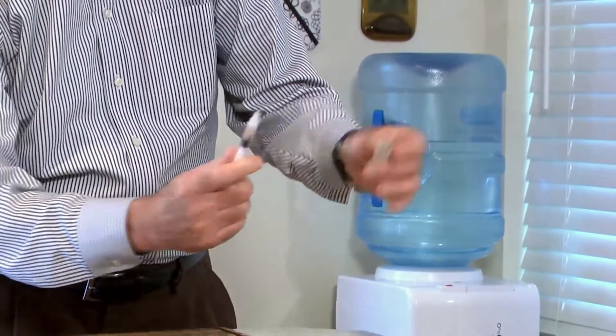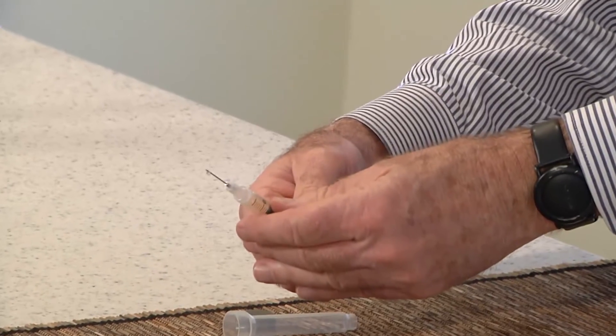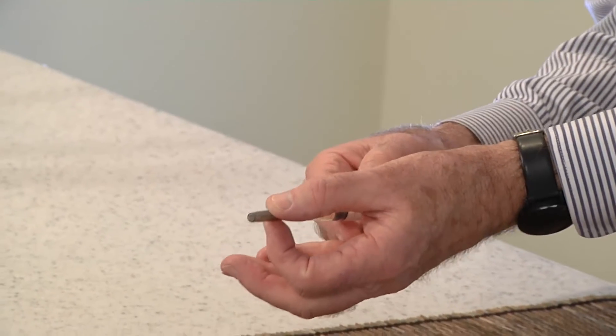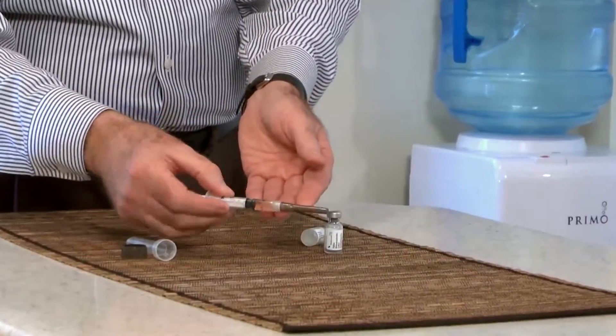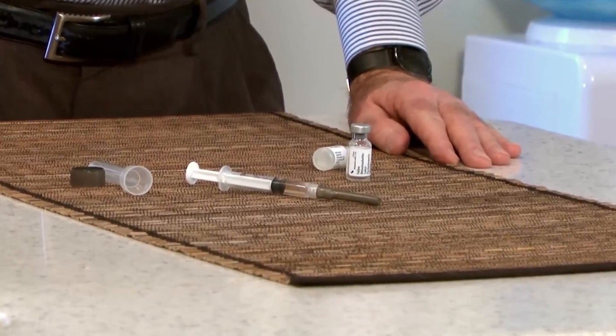Remove the syringe from the bottle and push the plunger until the air is removed and you see a few drops coming from the syringe. Put the cap back on the needle. The vaccine is now prepared and you're ready to vaccinate your pet.